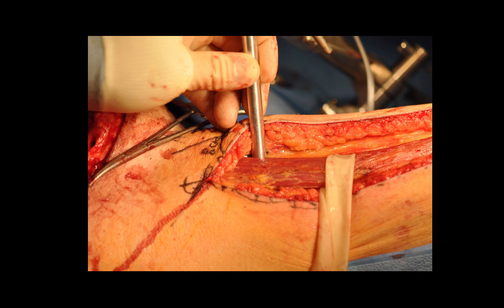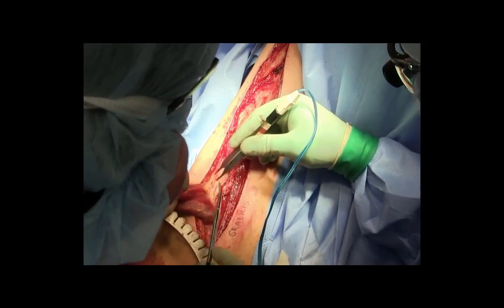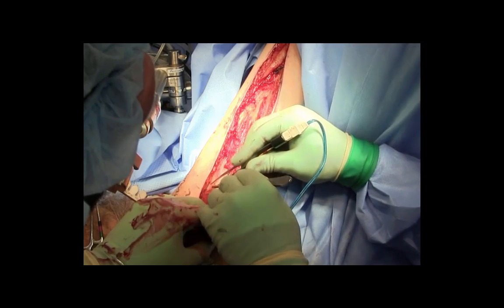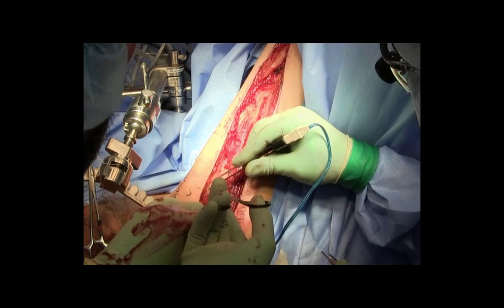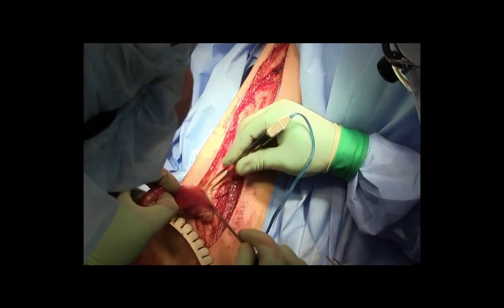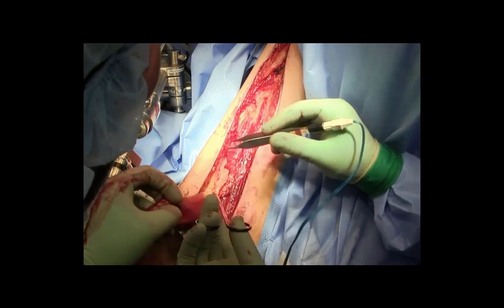Here's a picture from a previous case showing Doppler ultrasound being used to localize the pedicle to the gracilis flap. This arises underneath the adductor longus and has a large pedicle supplying the majority of the longitudinal blood supply through the gracilis. Tissue surrounding the pedicle needs to be carefully dissected free. Freeing up the pedicle underneath the adductor longus will give you the most length for applications of the gracilis deep in the perineum. An Adzen-type bipolar is very helpful here to prevent jumping of the muscle and damage to the pedicle.